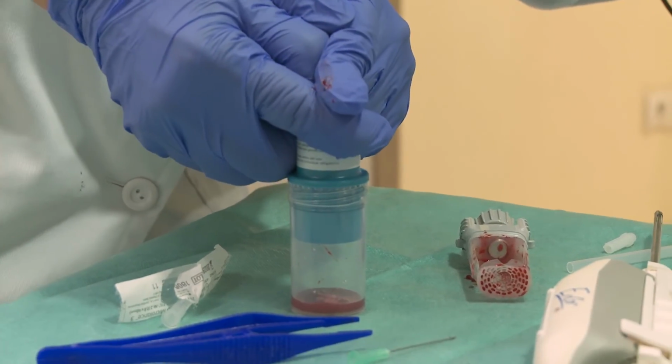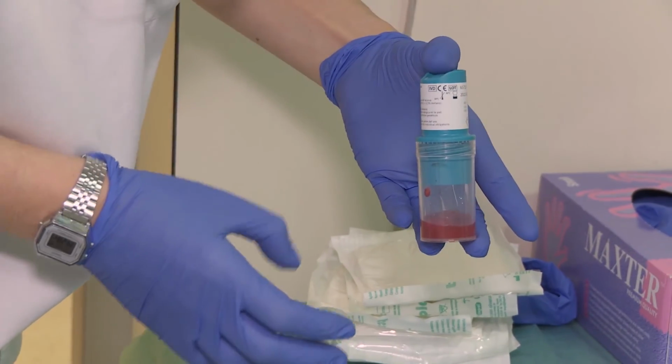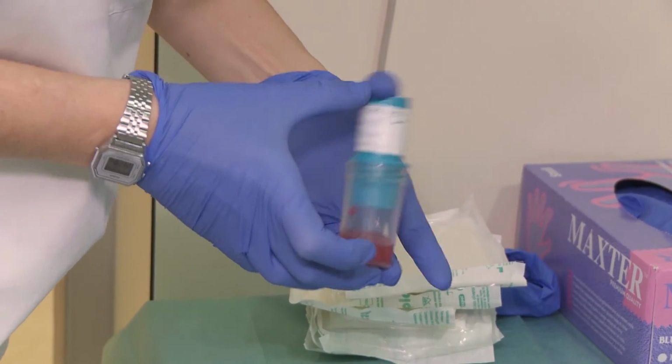Push the container cover down firmly to ensure the samples are covered with formalin.